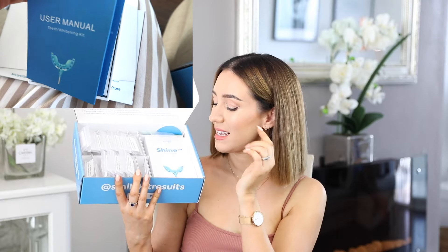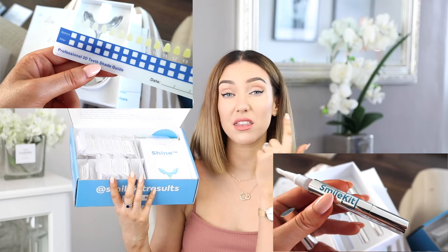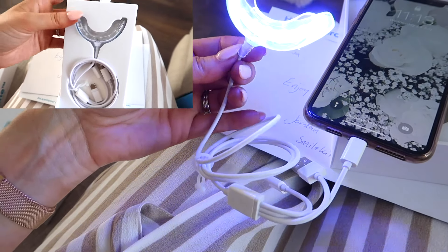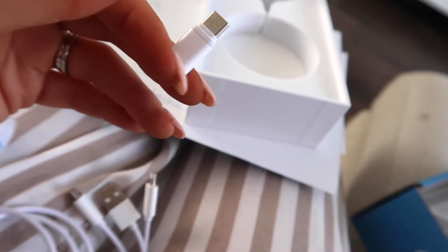Underneath that is the teeth whitening kit, which includes a pen with a twist-up dial on the bottom. You apply the gel to your teeth, not your gums. There's also a light that you plug into the bottom of your phone - there are a few different adapters to fit different phones - and that powers the light for the treatment.